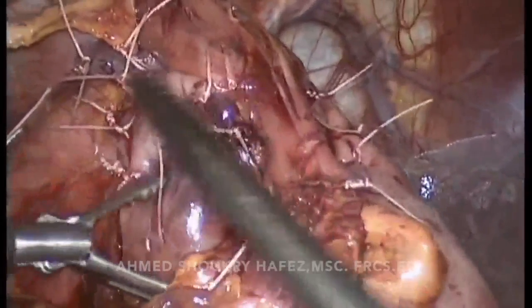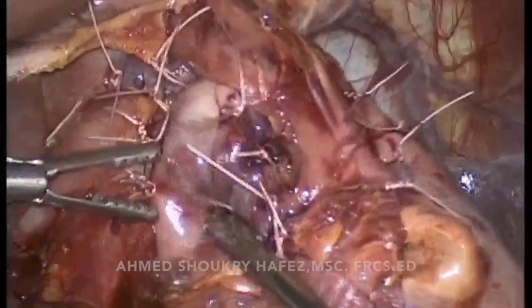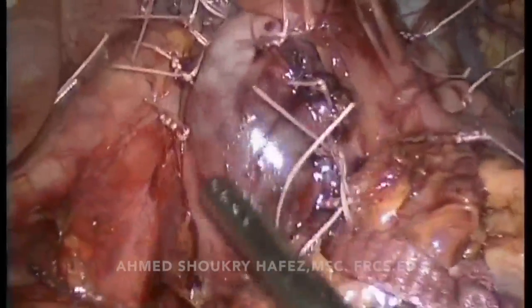Now you take down the tape, cut it, and remove it, and you do not place it anywhere.